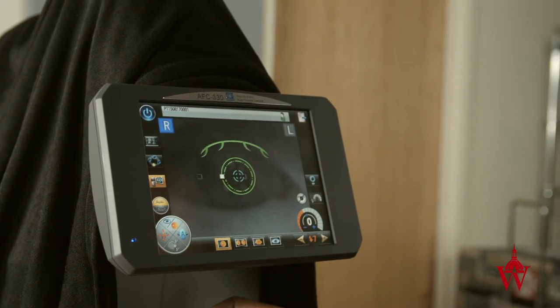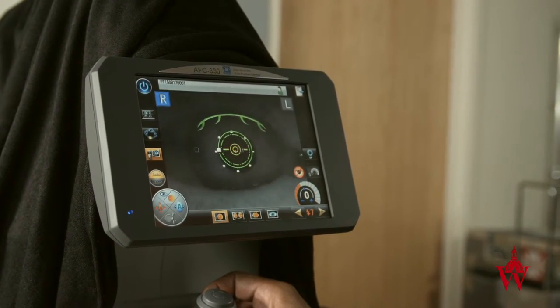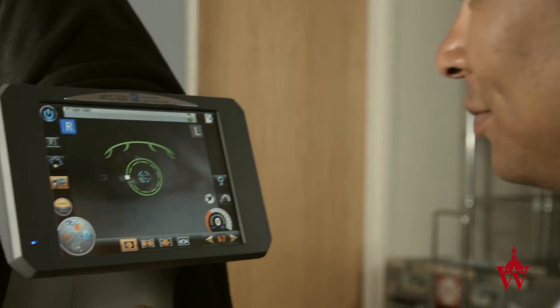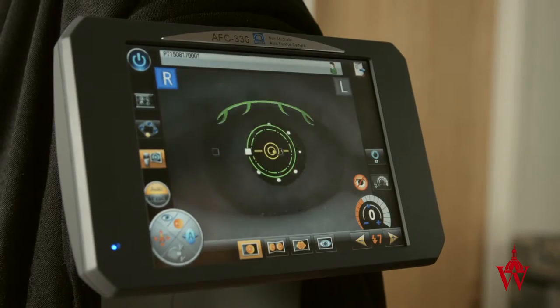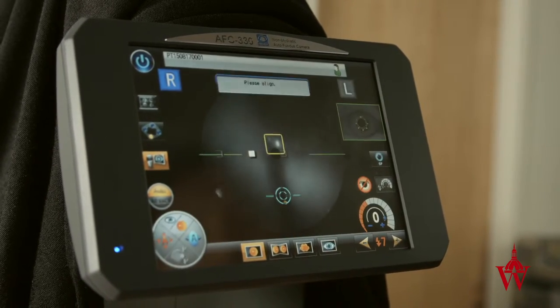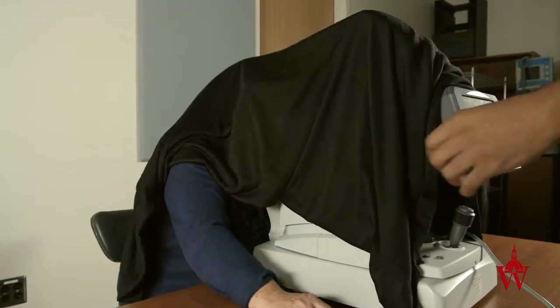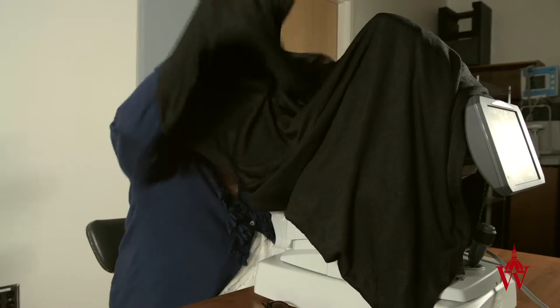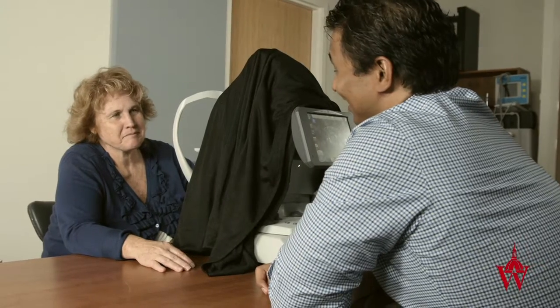If the patient cannot open their eye wide enough or hold their eye open long enough, tell them they are welcome to blink as much as they want until you instruct them to keep their eyes open, then ask them to hold it open as wide as they can so you can take a picture. In some cases, a patient may be open to having someone assist by helping their eyelids. If a patient feels uncomfortable because of the cloth over their head, explain that the reason behind the cloth is to get a good picture and it will take less than a minute.